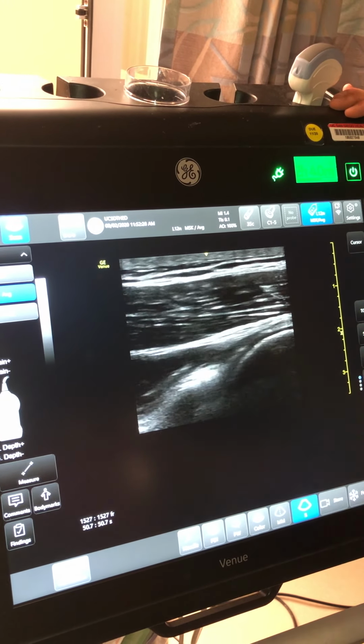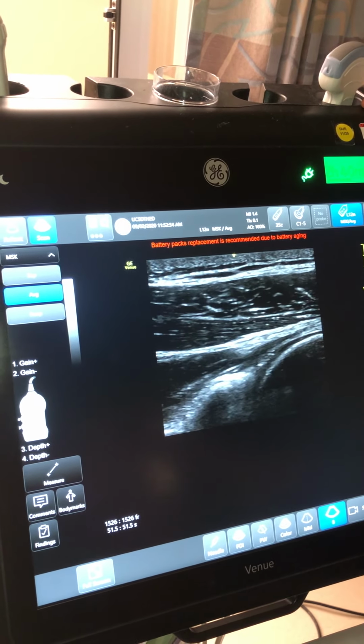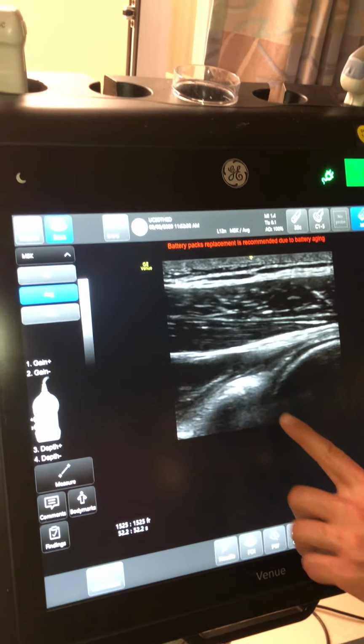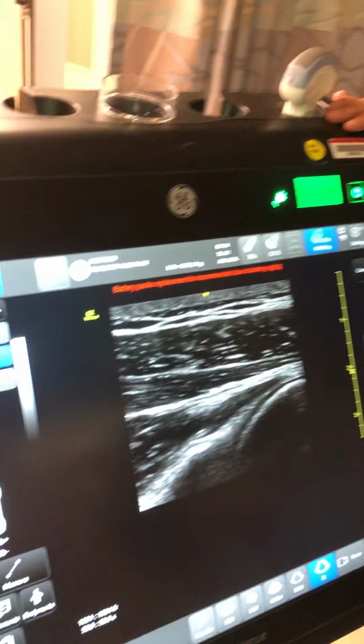In between, in that little hyperechoic kind of triangle in between the glenoid and the humeral head, is the view of the posterior labrum that we can see at the back of the shoulder. Is that also where you were looking for nerve impingement as well, or shoulder impingement syndrome? So shoulder impingement we'll do on the lateral side.